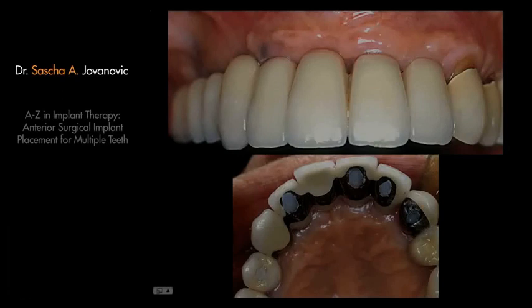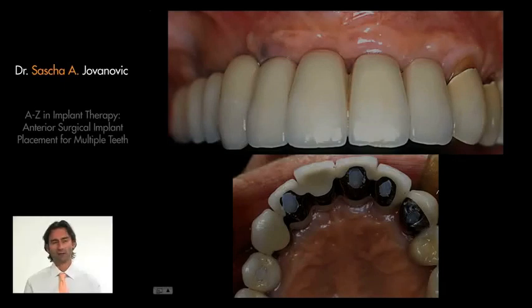And today with the zirconia bridges, you don't even see this difference in color between the metal and the composites because everything is white, so it disappears quite nicely. So screw retained restorations are actually making a comeback today because of course they give the advantage of retrievability.